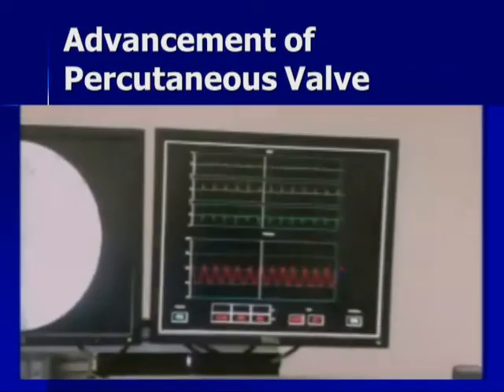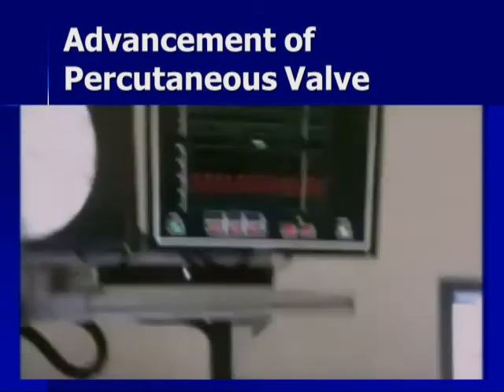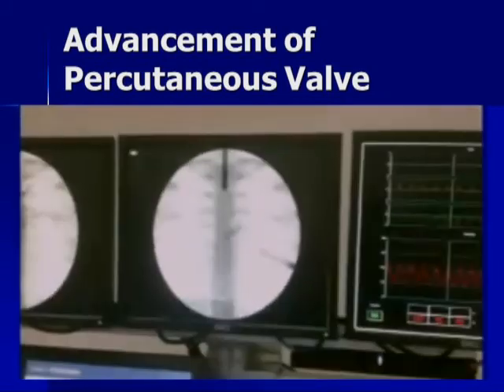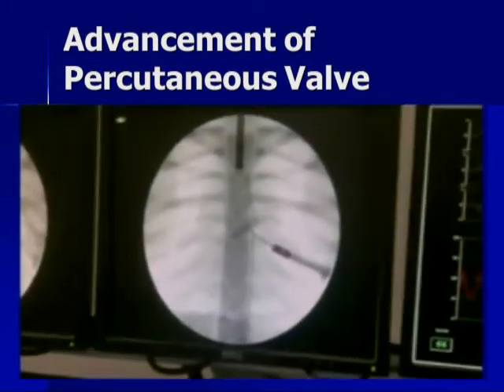So the big keys of this: you have to pace the heart rapidly so there's no blood pressure. You have to give appropriate pre-medications to get the blood pressure up, because magically when you stop someone's heart who has bad heart failure, they don't bounce back. Our anesthesiologists, our cardiac anesthesiologists really drive the show on this. We work closely with them.